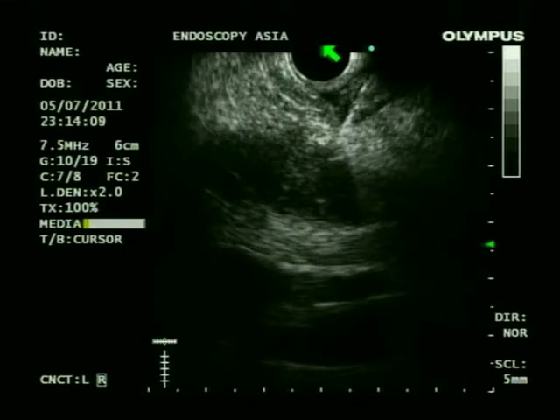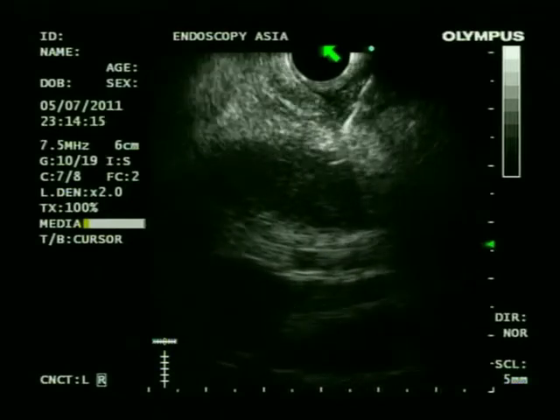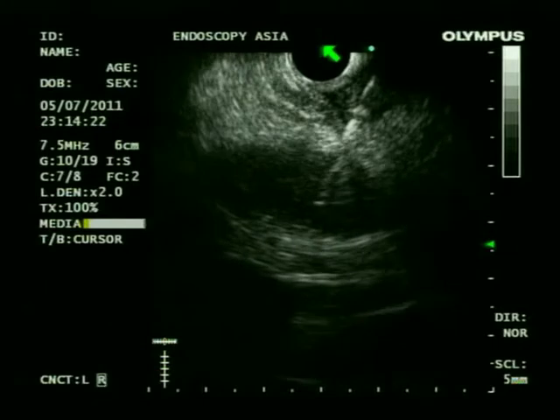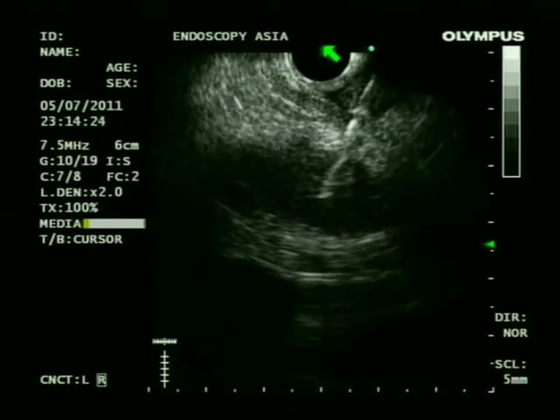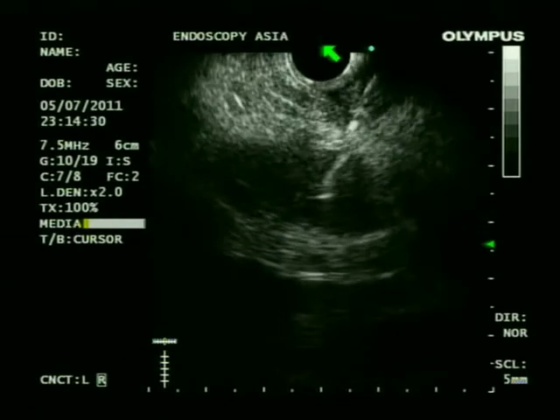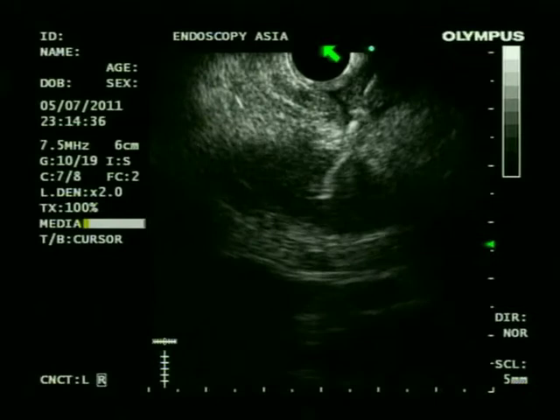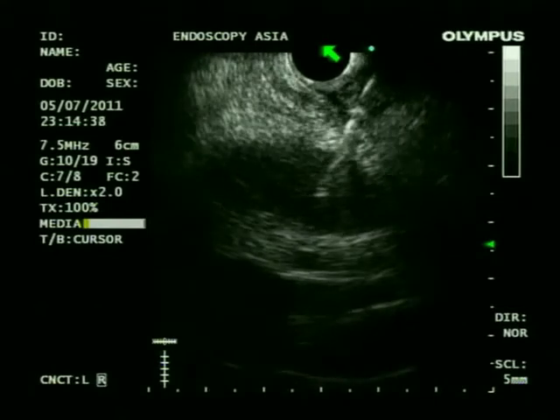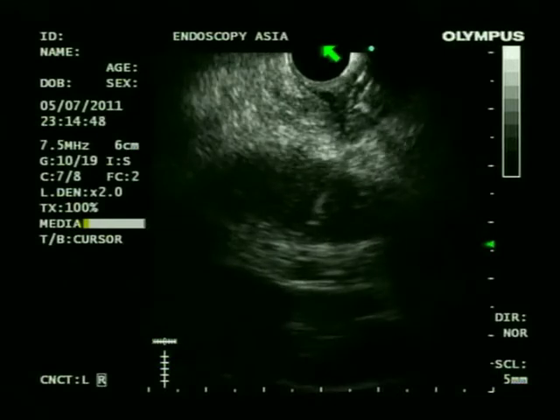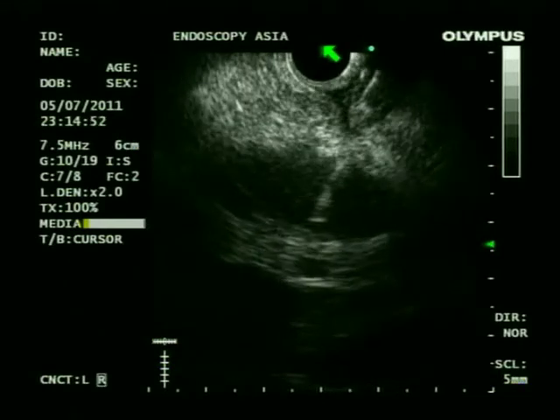We are doing EUS guided FNA. We prefer to use a 25 gauge needle usually for this kind of interventions, as we can get a fairly good amount of material for cytological examination. So whenever we have a patient who has definite indication for only palliation and not resection, we prefer a transgastric approach for tissue acquisition, as seen in this particular case.